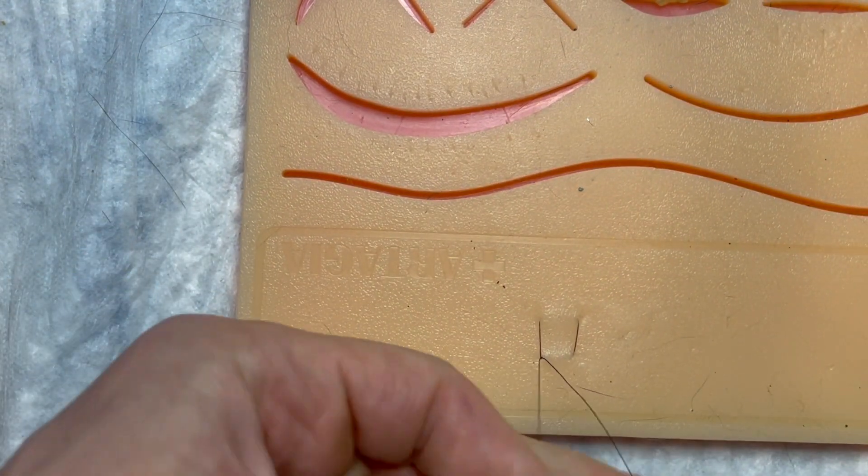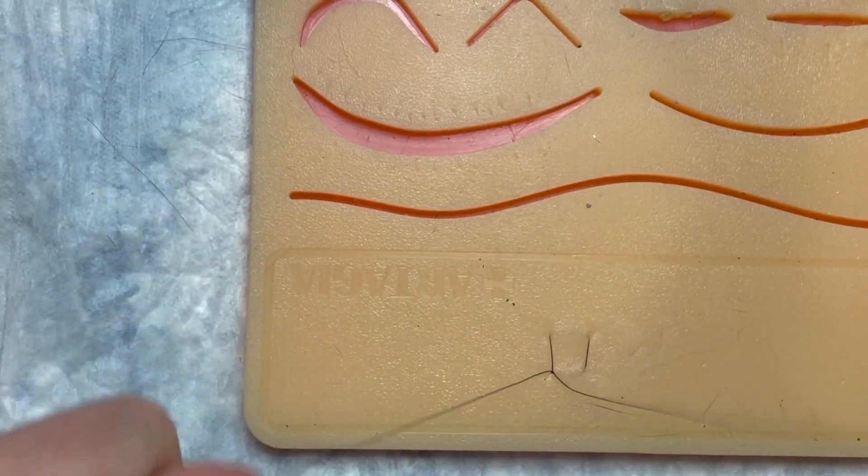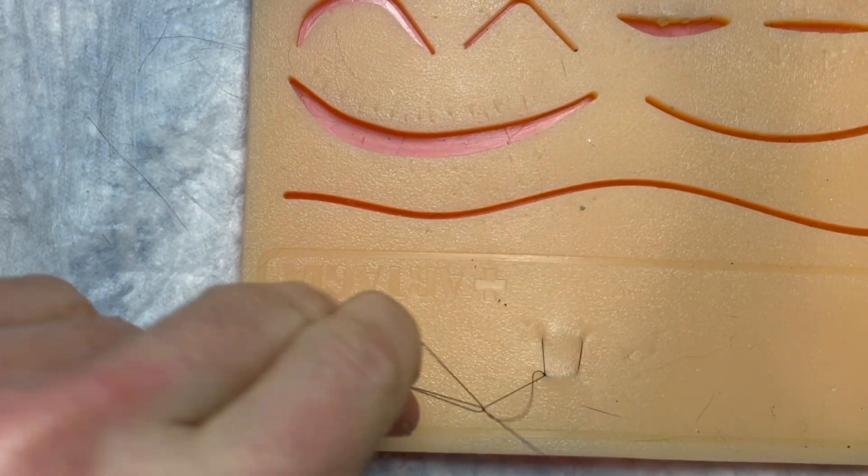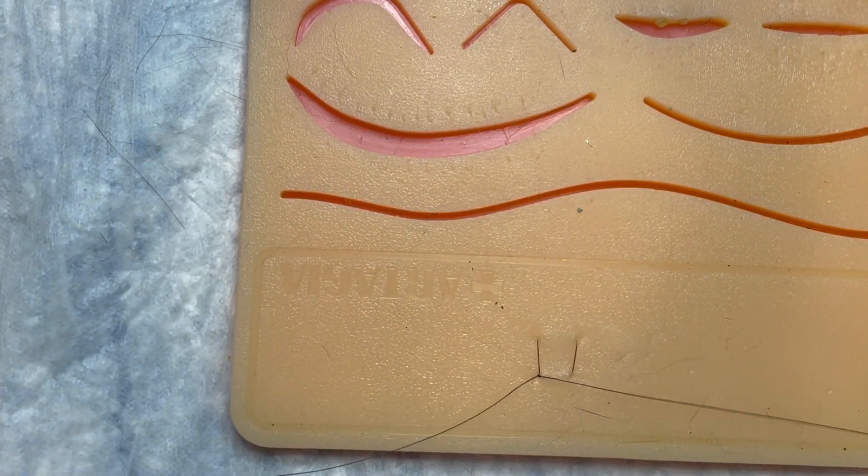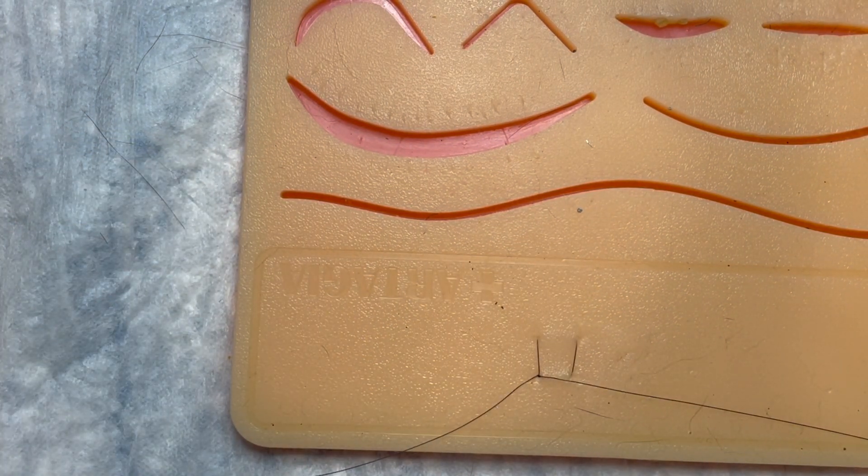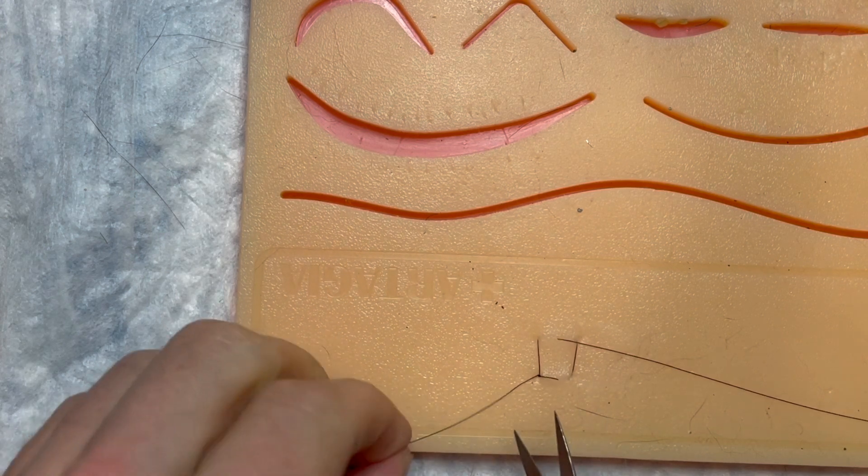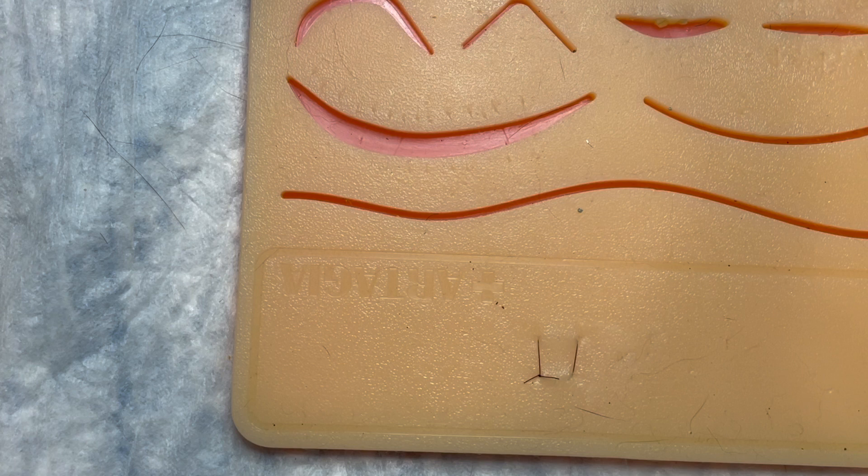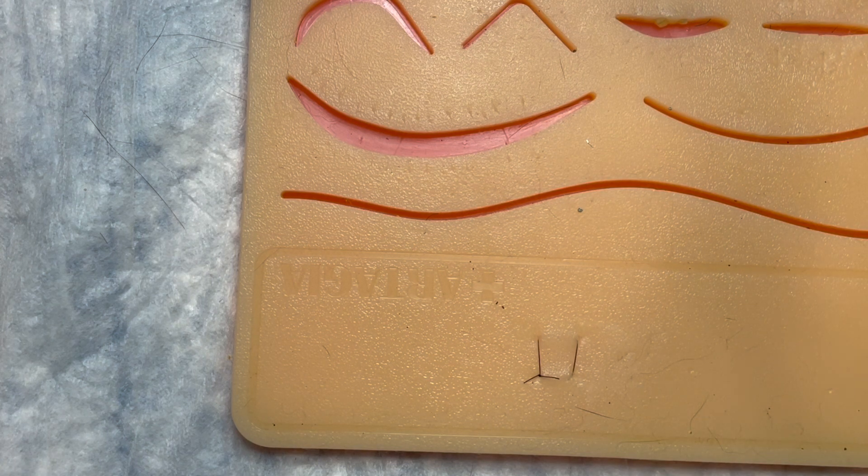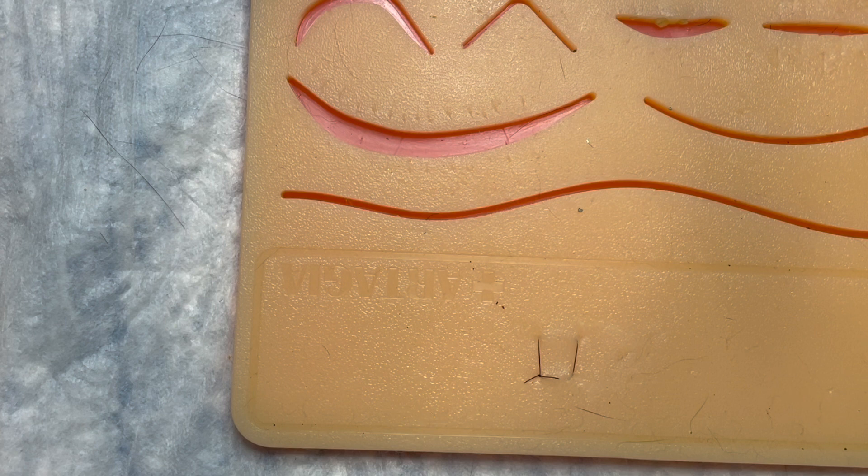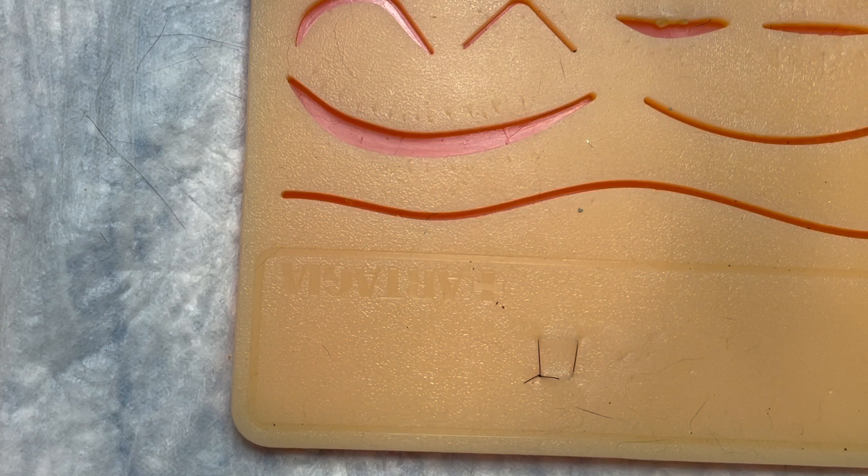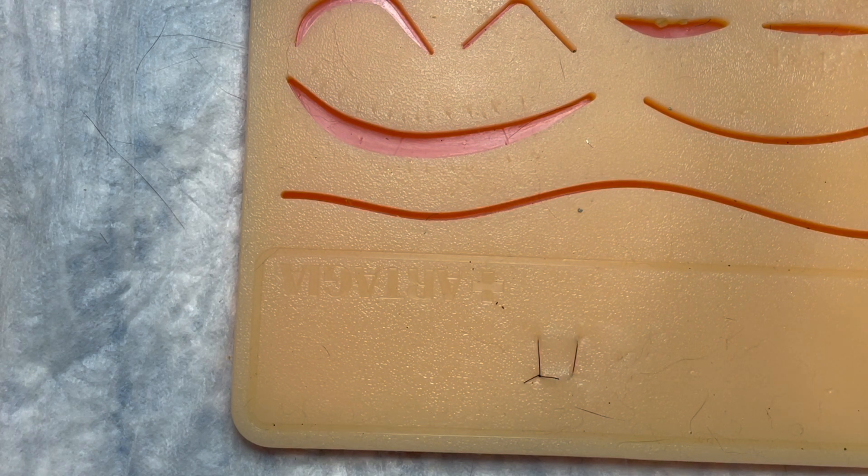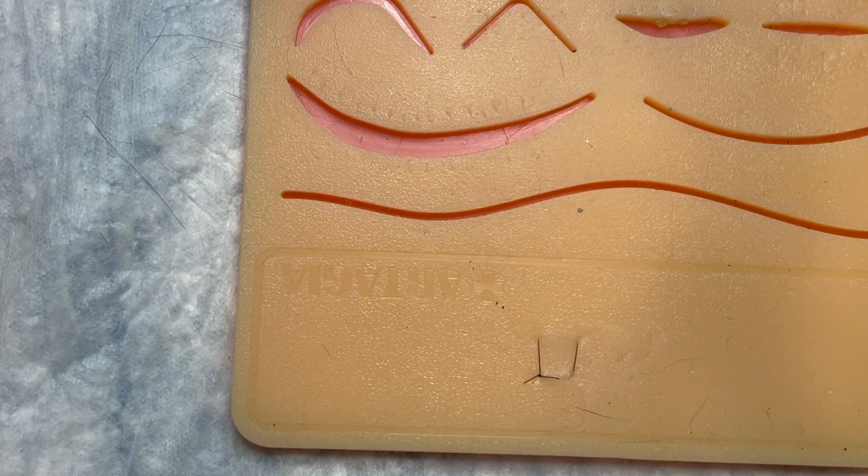So the really nice thing about the Soweto tie is once you do the suture material the first time you can actually use that same material to close off the wound. But that is a Soweto tie and that is how you secure a large bore chest tube. We've learned the L ties on each side, we did not do any roman sandal strings. So hopefully you guys are confident now to secure both types consistently and hopefully this video makes you guys better PAs and better clinicians as we're always striving to get better. I hope you guys found this video to be helpful and stay tuned for more.